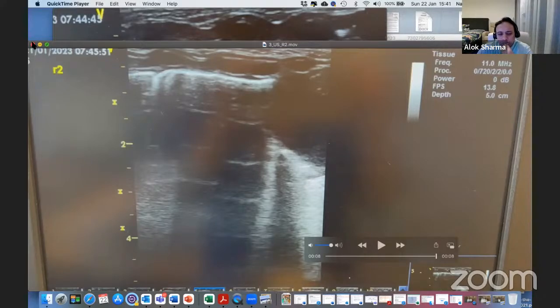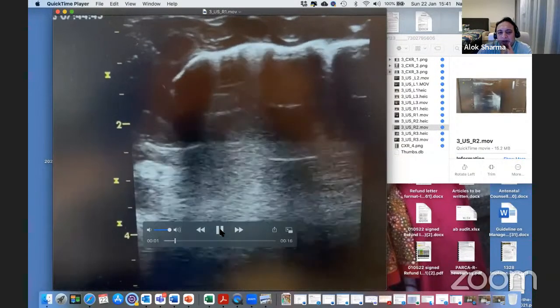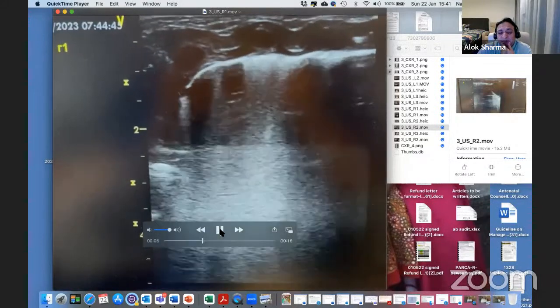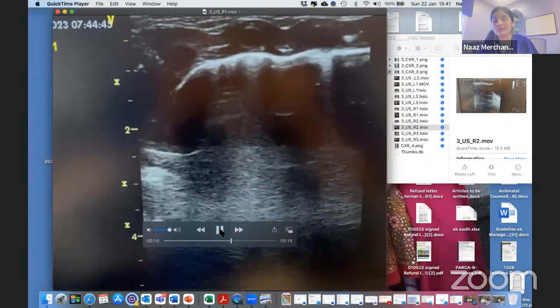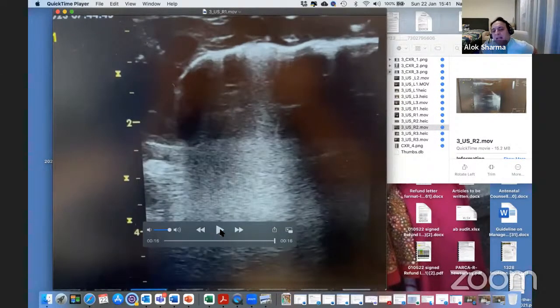Can we go back to your last image? So again, now that I've seen the previous image, that lower half of this zone, that is consolidation. So would that reflect, because this baby had clearly meconium aspiration. It's patchy consolidation. So what meconium aspiration classically presents with, and this is why the history is so important, is areas of variable consolidation without demarcation in different areas. A classical lobar consolidation, or what is called a translobar consolidation, occupies a defined anatomic lobar zone. So when you read the chapter on consolidation, you find I've classified them into translobar and non-lobar consolidation. And meconium aspiration classically presents with the absence of lobar or patterned consolidation in particular areas. It presents with patchy consolidation.